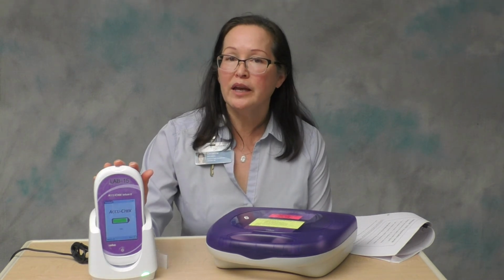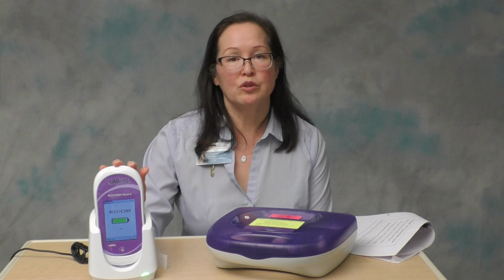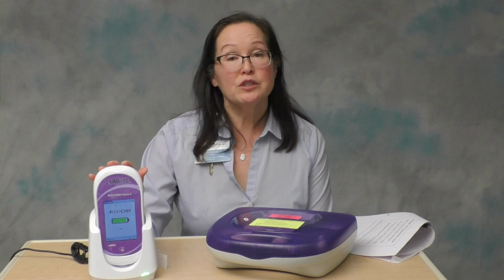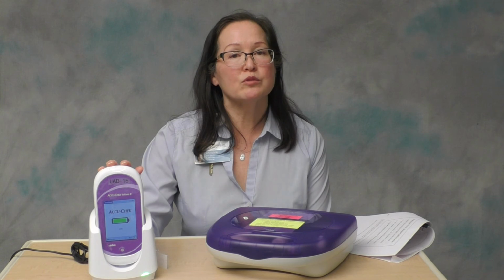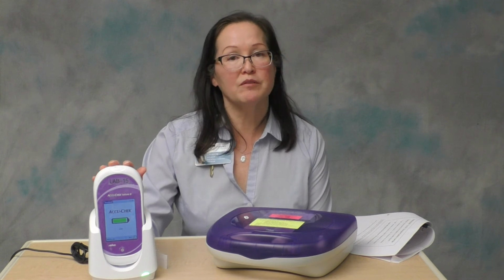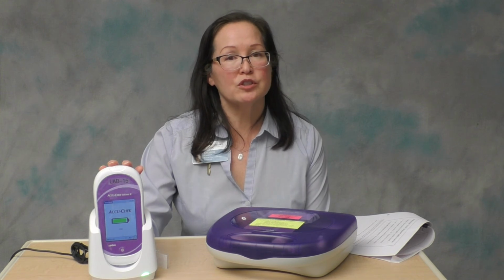If you get a high again, you're going to need to know what the glucose value is so you know how to dose your insulin. So for that reason, you're going to have to order a lab glucose test. The order that you want to put in is called a glucose recheck. That indicates it's a recheck of the meter value. It will not generate a new financial charge to the patient.